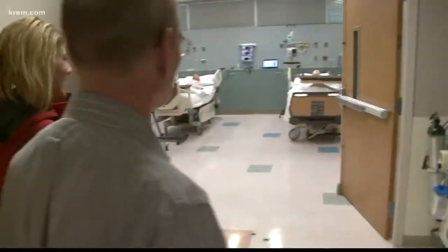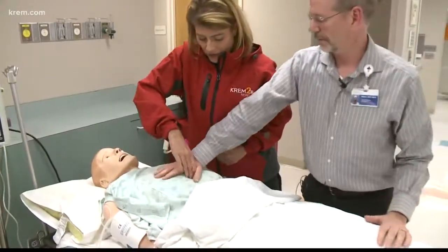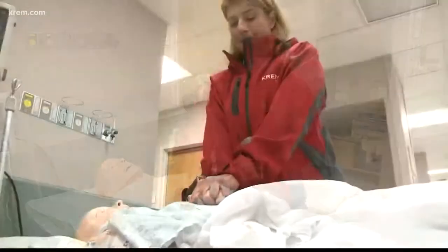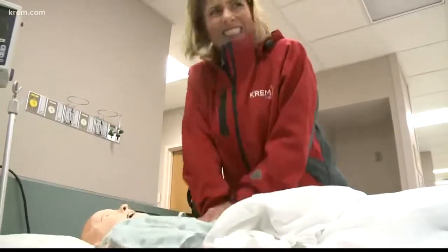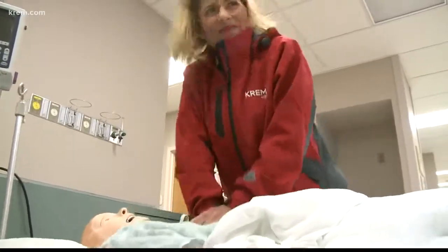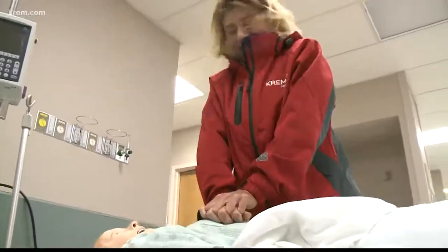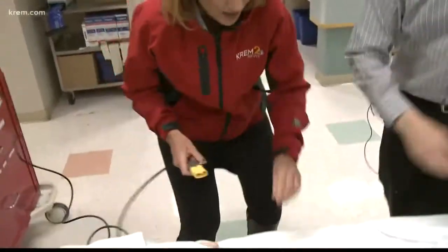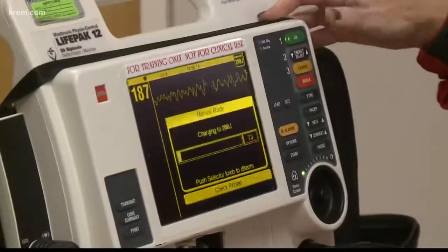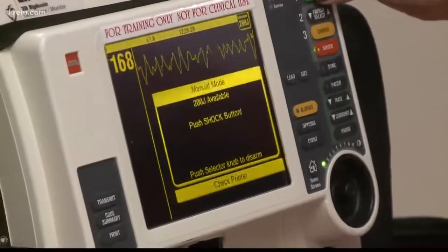Let's do it. As a cardiovascular perfusionist, I also have to recertify and complete life support training skills every 2 years. The staff at Sacred Heart let me put my skills to the test. It's not as easy as it looks. It's amazing how many people you can fit around a bed. It's an emergent situation. So you hook them up, those are your defib cables. And then before you hit the shock, you're going to make sure everyone's clear because we're actually defibrillating. All right, stand back, all clear.